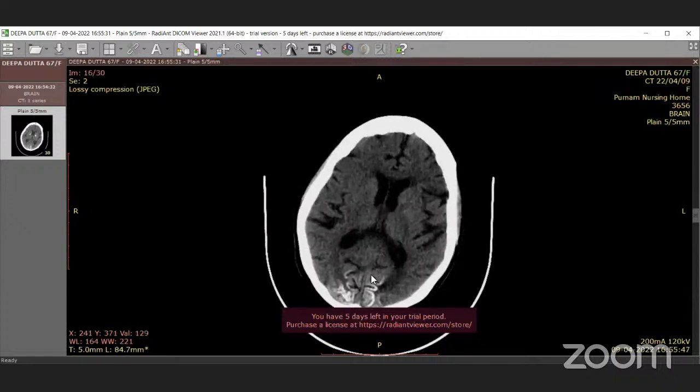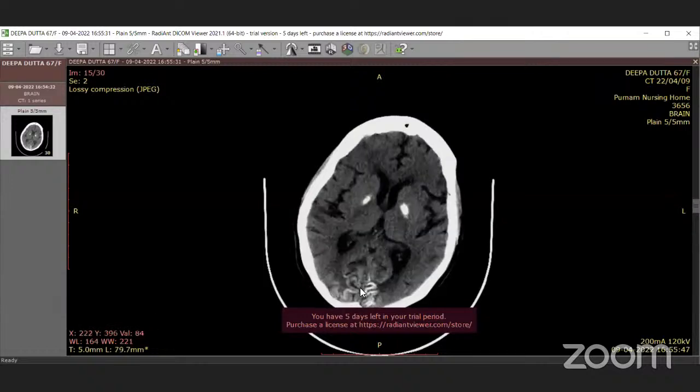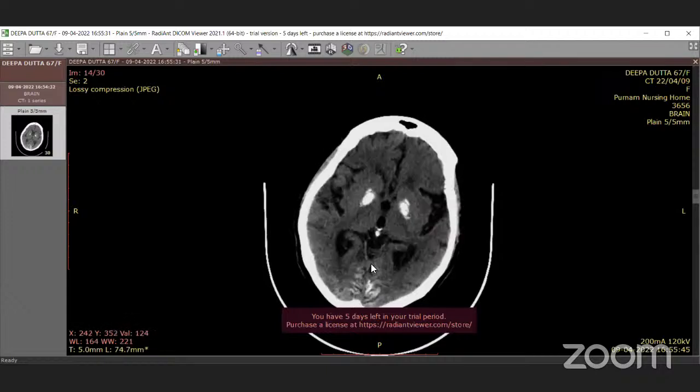Yes, absolutely, sir. This is the falx, posterior level of the falx, and this V is the cranial most part. The first V that we see forming is the cranial most part of the tentorium cerebelli. The entire tentorium and the falx form a Y-shaped structure.